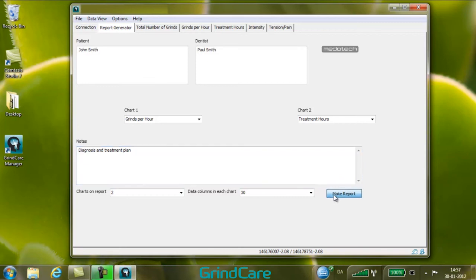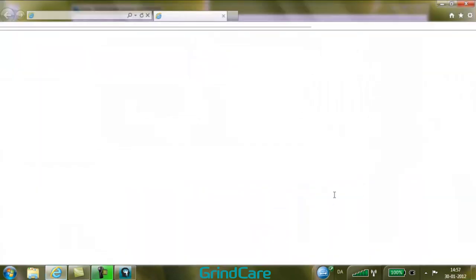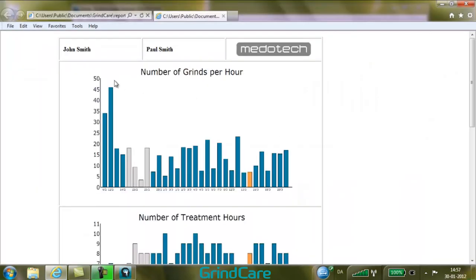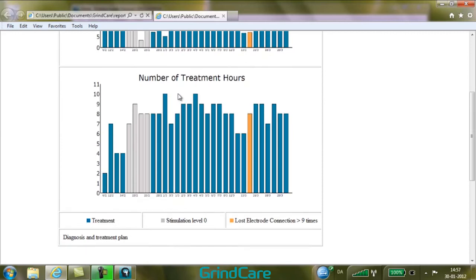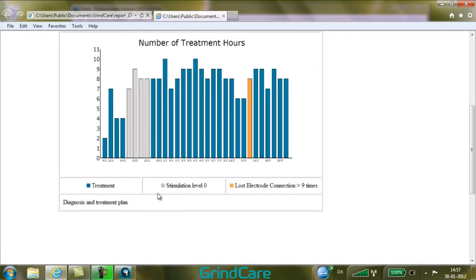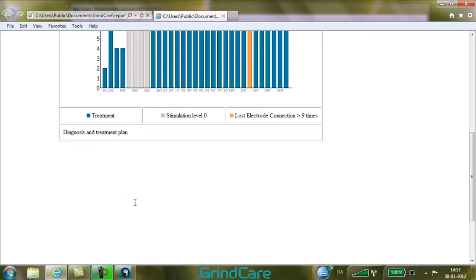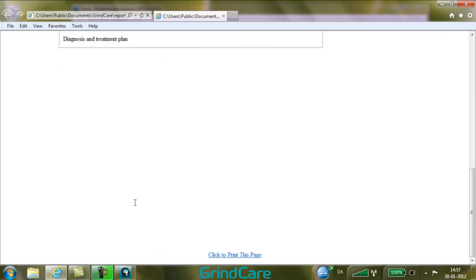Click Make Report and the report is generated. The report opens in your browser and you can see the various sections of the report. The report can be printed by clicking on Click to print this page at the bottom of the screen. After printing, close the report.